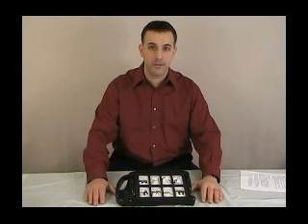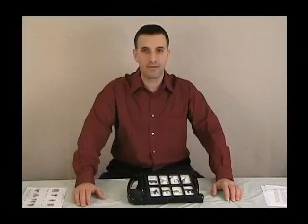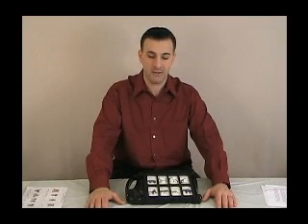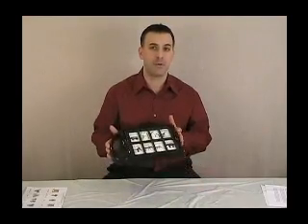Augmentative communication devices can be used for the simplest, relaying everyday tasks or needs to a caregiver or therapist, as well as many other functions. The frequently asked question is, what are levels and how do you use them? When pertaining to a communication device, a level is basically a retained set of messages. And our example is our 7-level communication builder.